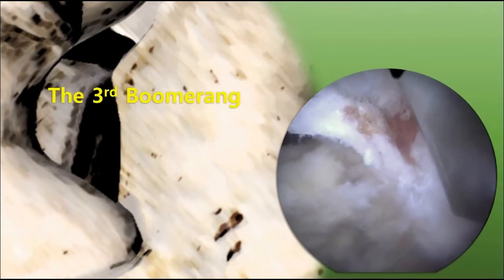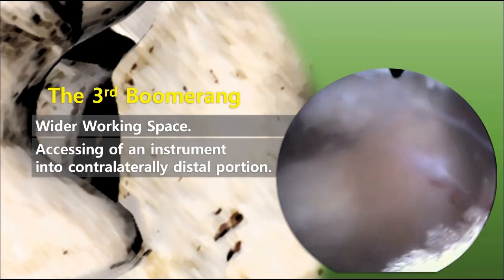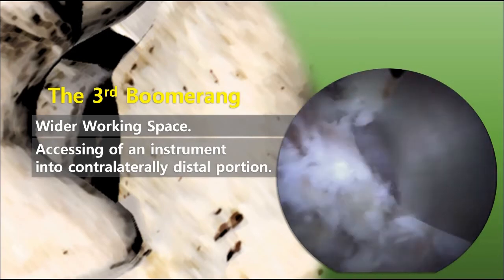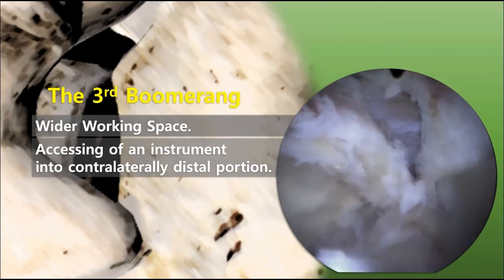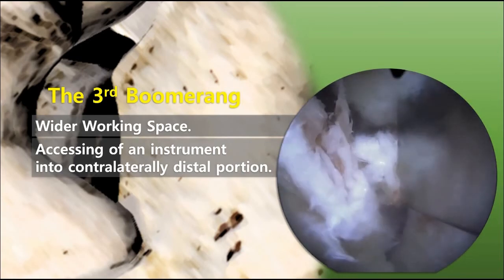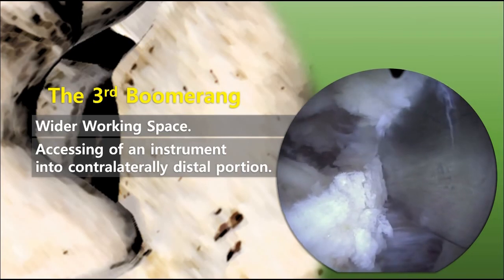Distal SP base resection, so called making the third boomerang, is a simple procedure, but it gives you wider working space. The distal SP base is frequently fighting against your instruments such as a burr or a Kerrison punch. After resecting it, all the instruments can move freely, especially when accessing the contralateral side area. And distal laminectomy is done simultaneously.